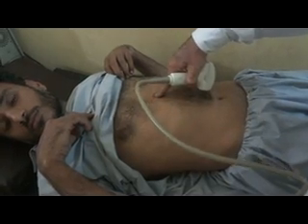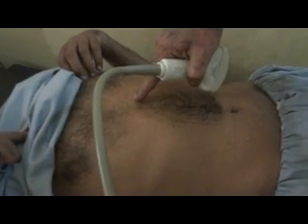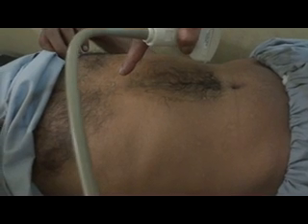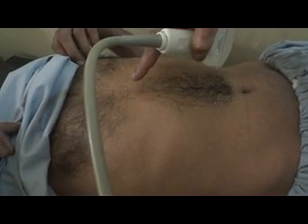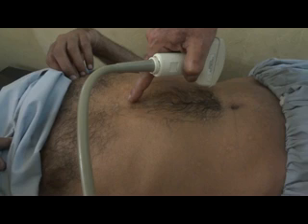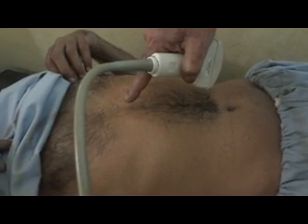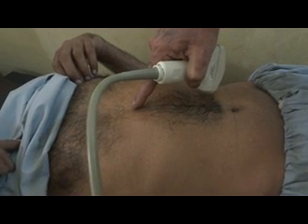Let's study the normal pancreas and how to scan it. What is the scanning plan? What are the scanning angles that you will be employing for the visualization of a normal pancreas? This is the xiphoid process, this is the subcostal region, and this is the epigastric region.